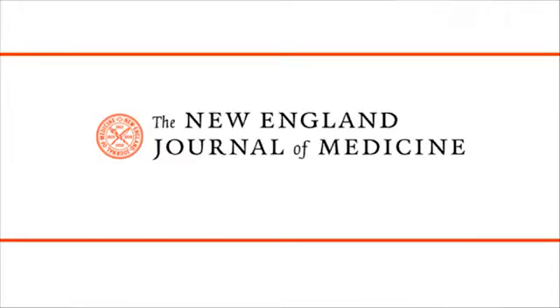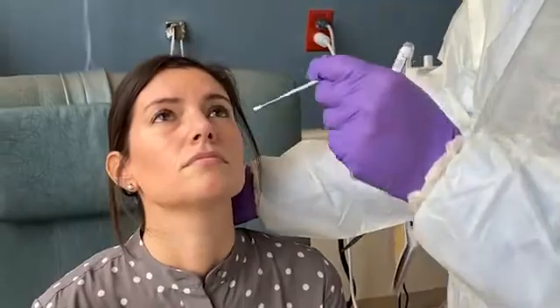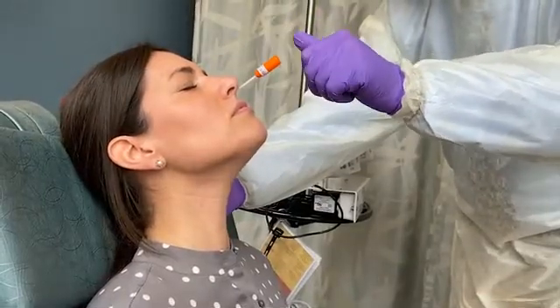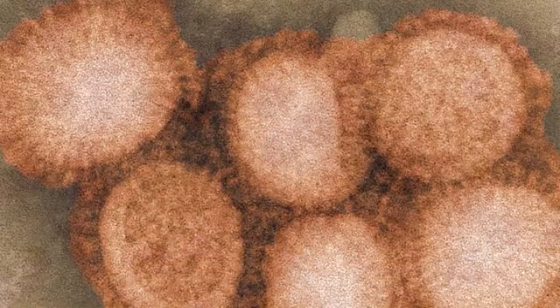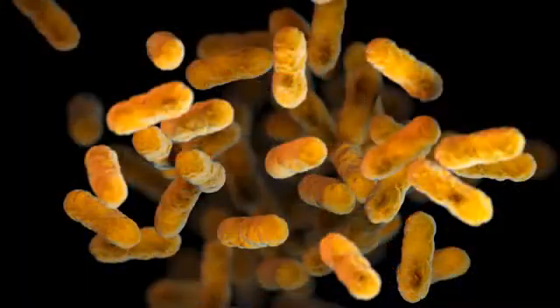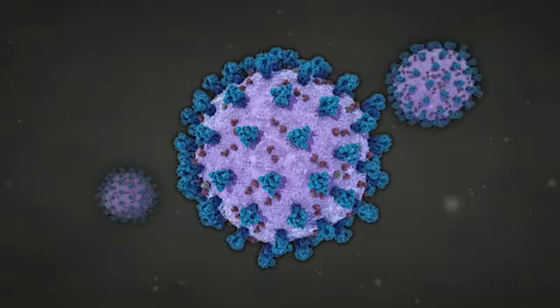This is a video in clinical medicine from the New England Journal of Medicine. Collecting specimens from the surface of the respiratory mucosa with nasopharyngeal swabs is a procedure used to diagnose COVID-19 in adults and children. The procedure is also commonly performed to evaluate patients suspected of having other respiratory viral infections or certain bacterial infections. This video describes collection for detection of COVID-19.